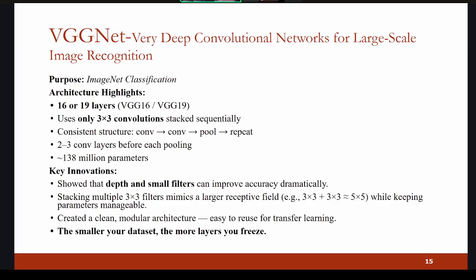Basic features, say for example edges, those basic features which were learned from the ImageNet data set, will be frozen, and the rest of the layers you can unfreeze and train the VGGNet architecture with your medical image data set. This task you call fine tuning.